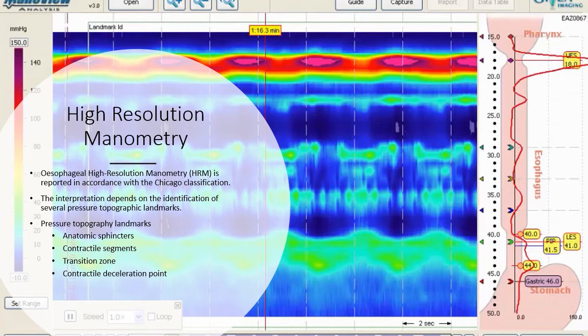These landmarks include anatomic sphincters, contractile segments, transition zone, and the contractile deceleration point.